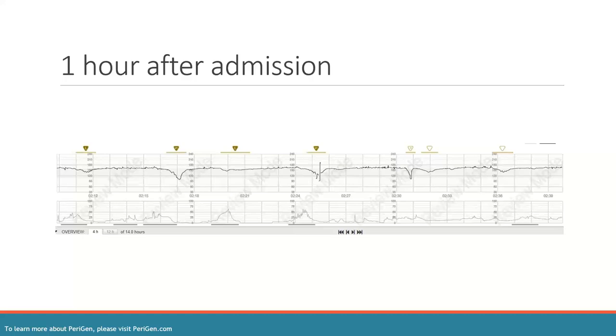It does give me the weight of the patient. So if she's fluffy and we can't get a good external monitor, maybe consider using internals at this point. Contractions need to be palpated, toco readjusted to ensure accuracy of uterine contraction monitoring. RN continues to monitor the patient and does not call the physician with an update. So obviously that's a red flag. We're continuing to have signs of decompensation. And the RN also has another patient and is busy going between two rooms.